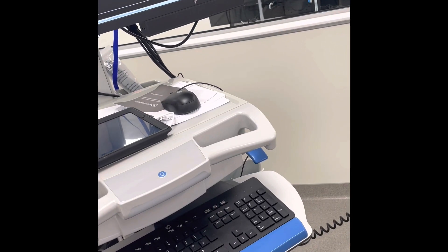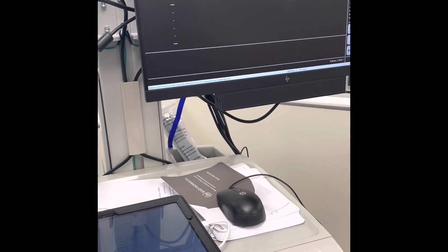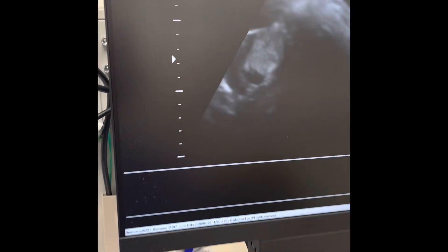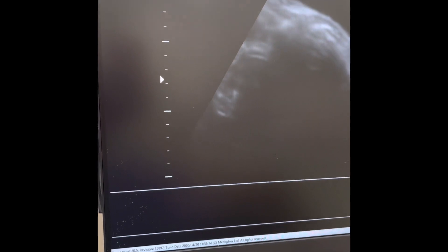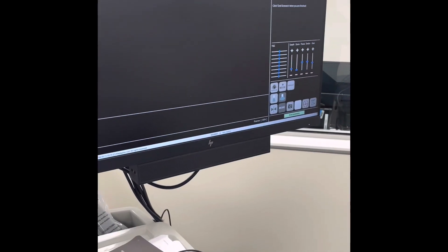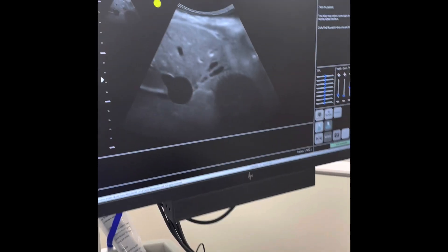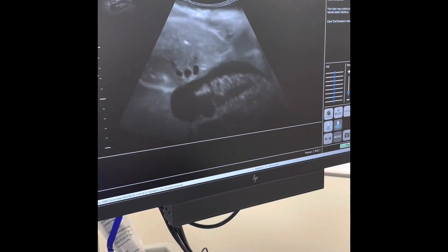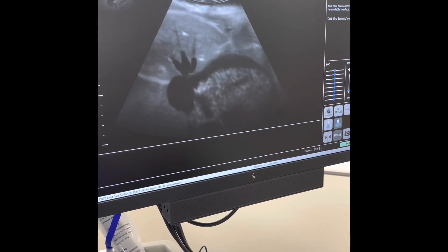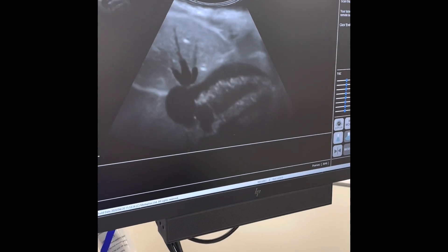I go down to the pelvic area, and as I am scanning the pelvic area, there you go — that's her baby. Now Maya will show everything that you should be seeing with a tamponade. Here's a subcostal view. Right there — that's a tamponade.